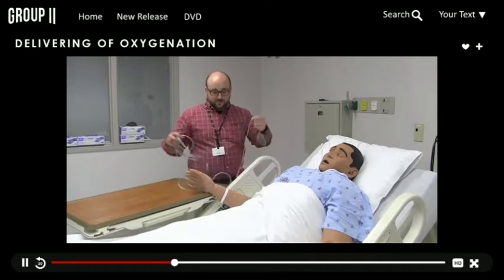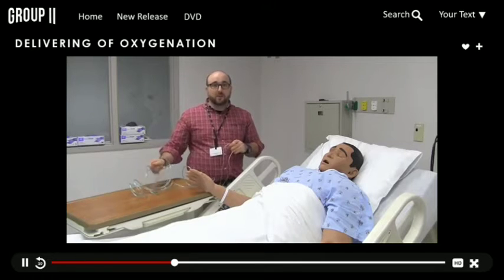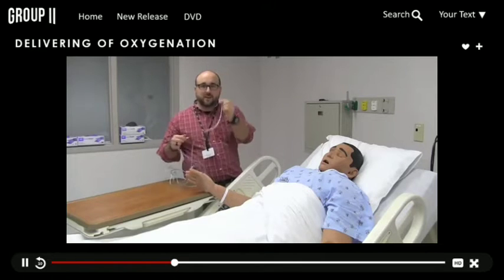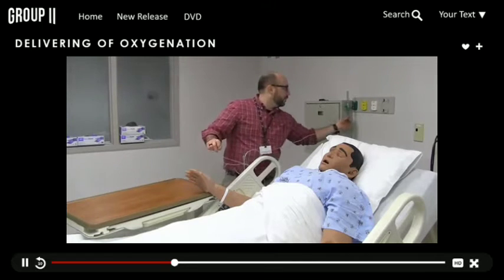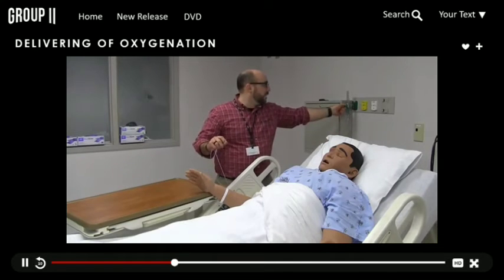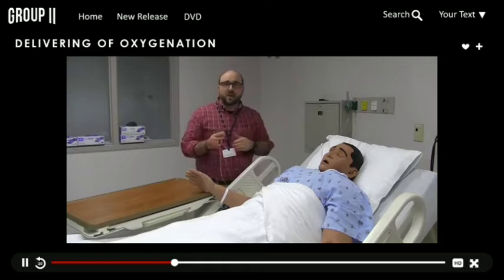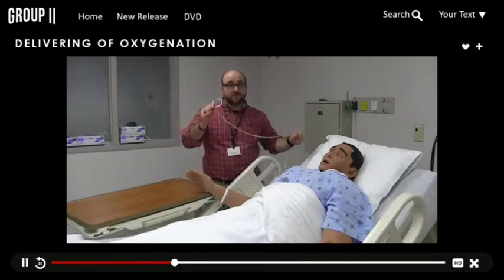So standard cannula, nothing really special about this. First of all, it will plug into the flow meter, and that's fairly simple. You have to have a Christmas tree, as we showed before. It plugs in right here. I always start the oxygen flow, turn the knob counterclockwise, and let's go with 3 liters here. The ball is right in the middle of 3 liters. Now I'll show you how to apply it to the patient's face.